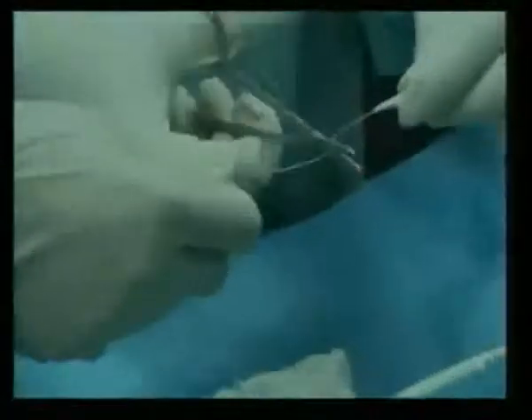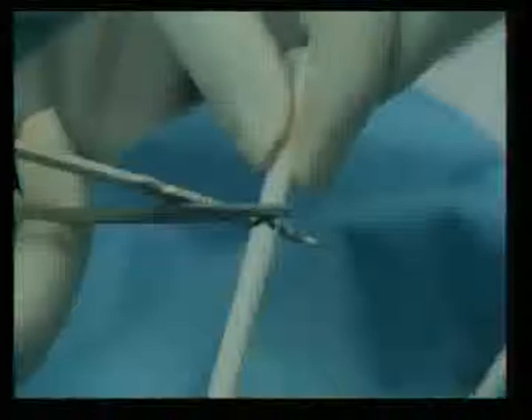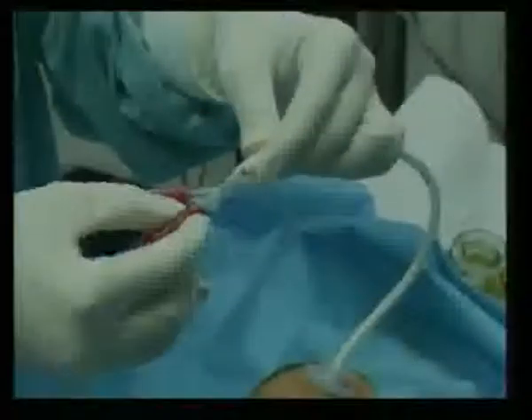If it's too tight, there's going to be ischemia too. So you decide where to cut it, and then this is the PEG tube you want to put there to support that. That's it. So we've cut it, and we will be able to feed. That is the feeding tube. You connect to that, and you can use it for 6 months.